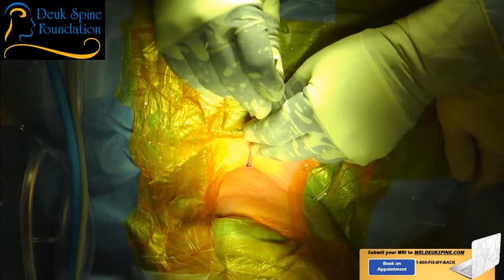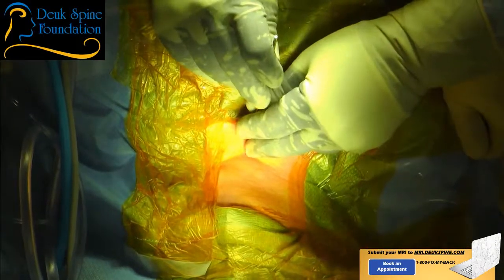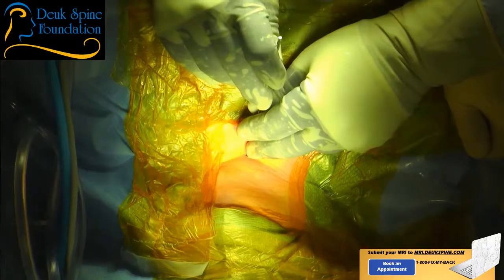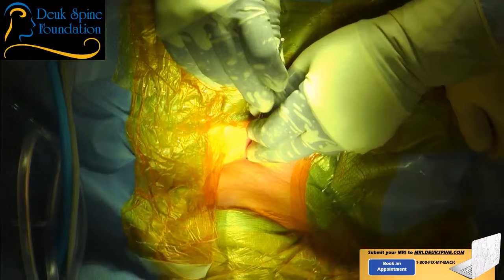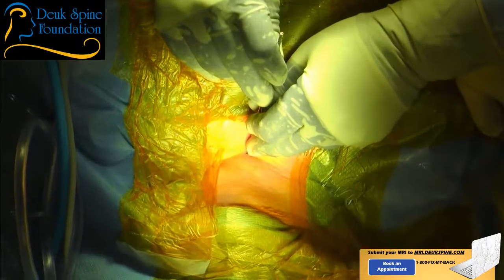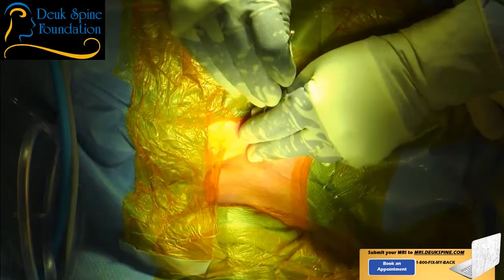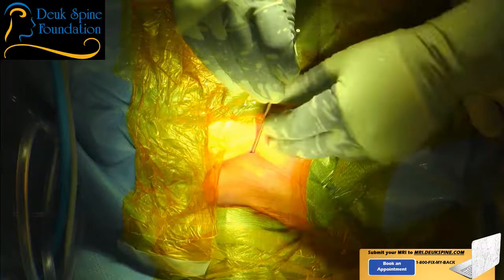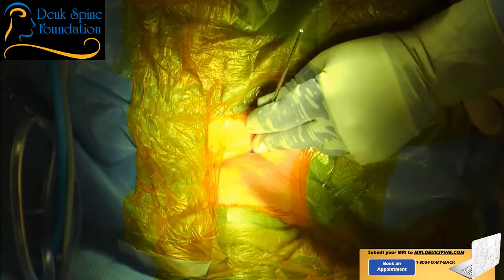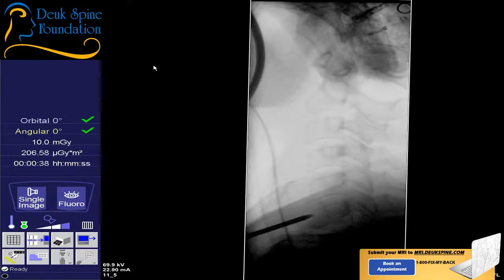Let me know when you're ready. Now, just get positioned, go ahead and take a shot, perfect. Now, move your fluoro slightly south, just slightly, a quarter inch. And you remember, you're squeezing in, Luis, and pushing down. Tell me when you're ready. Oh, that's beautiful. Just stay right there, don't move. Beautiful shot. Give me an AP. Don't move, Luis. Watch your face. Give me a quick AP.